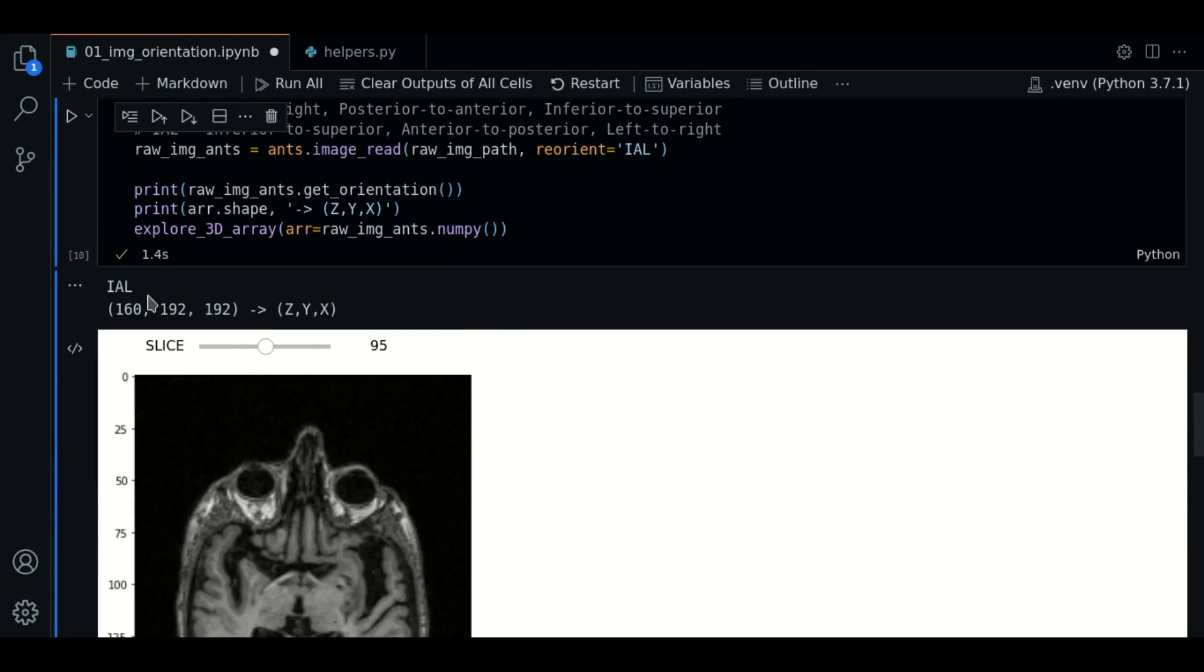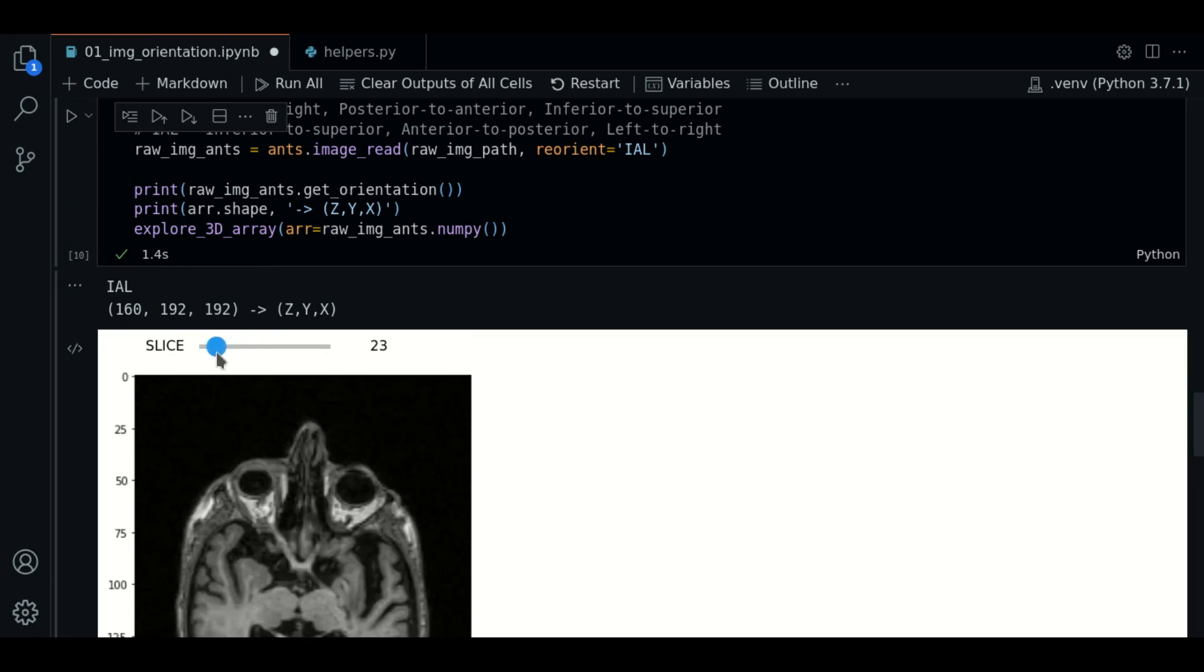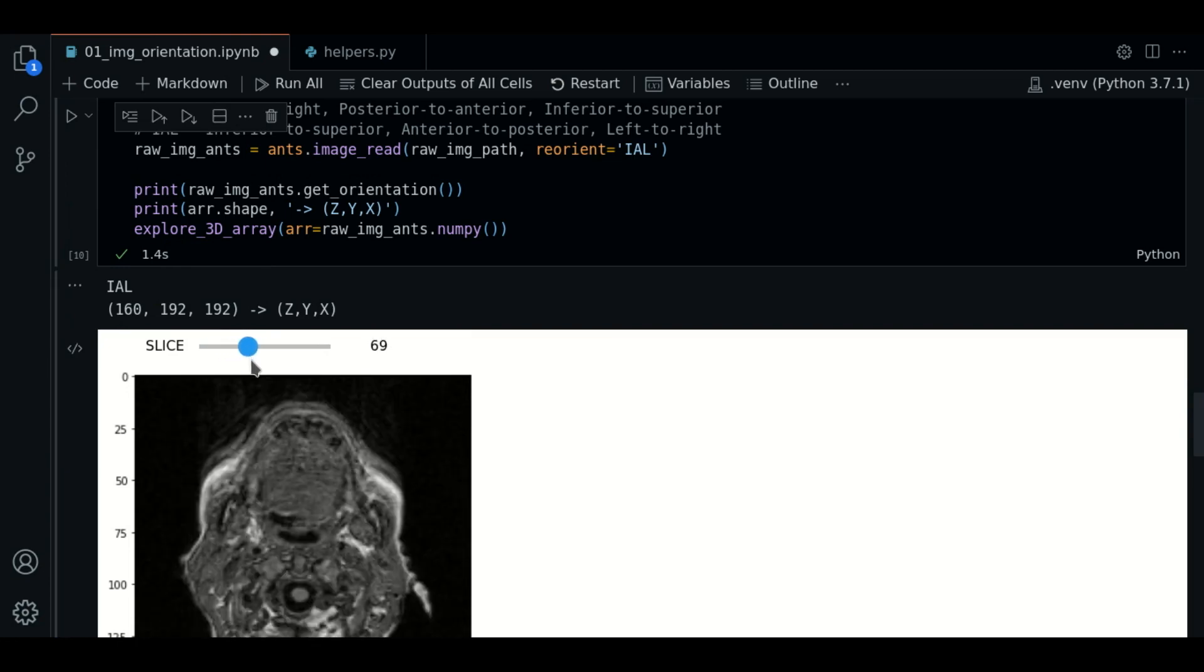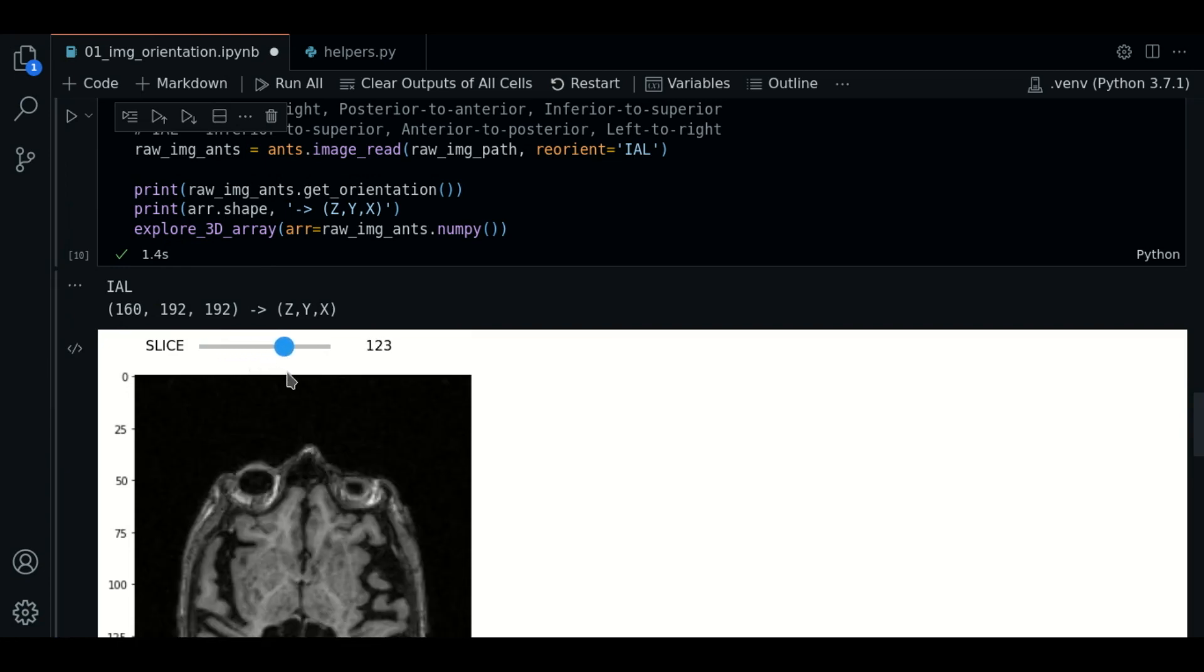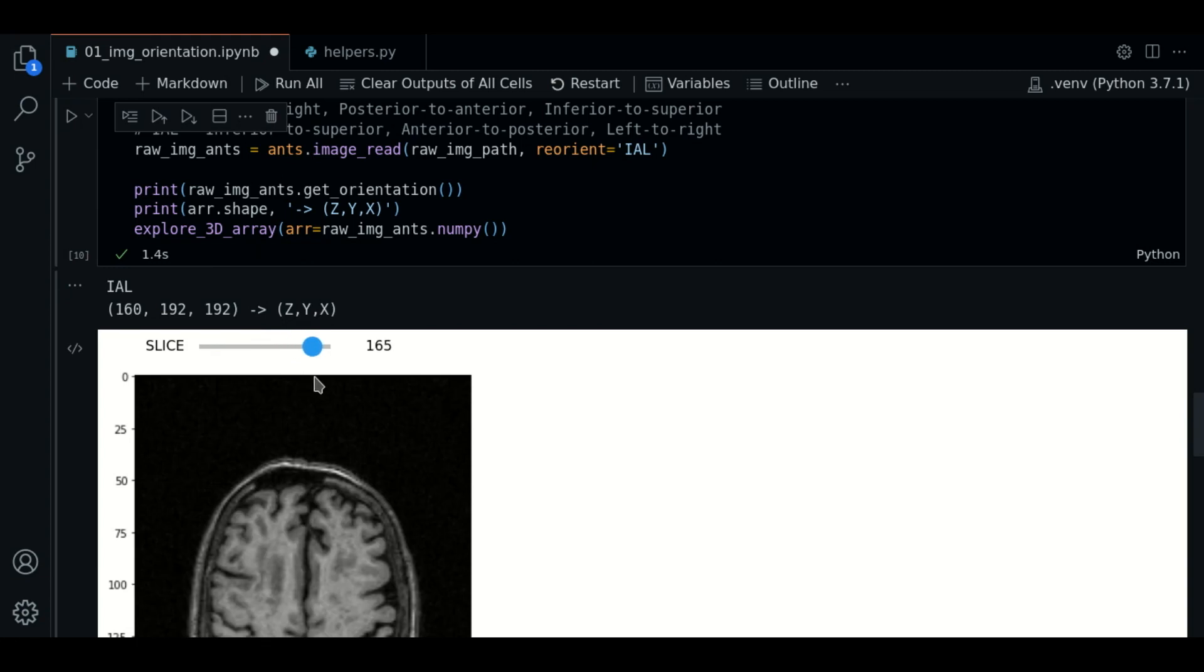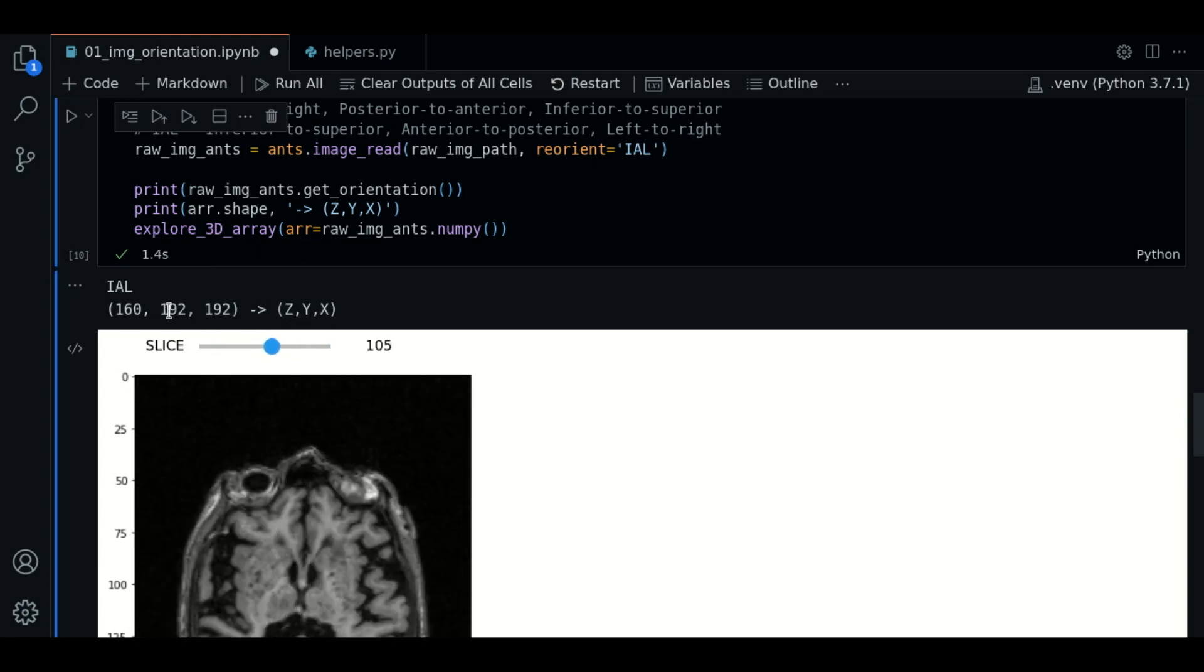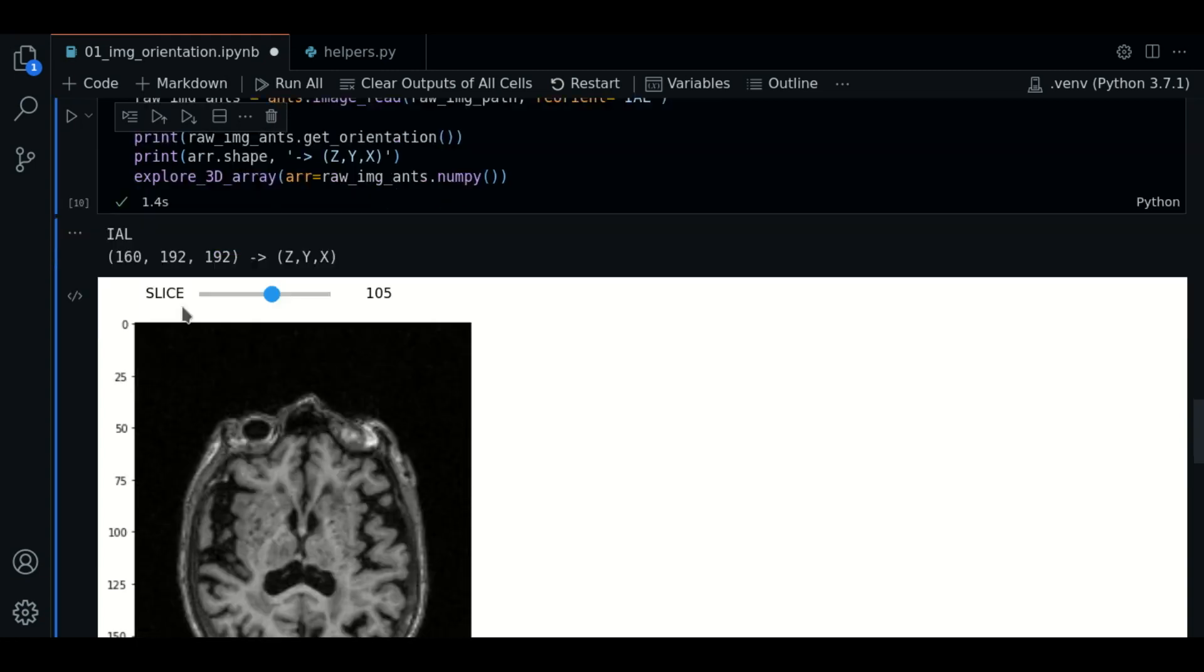So now, if we go along the first axis, we will see the orientation is inferior to superior now. That's great.